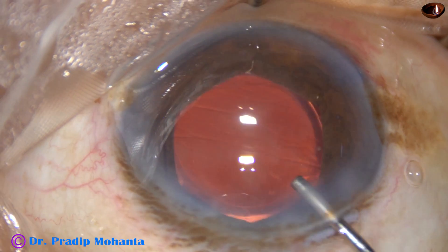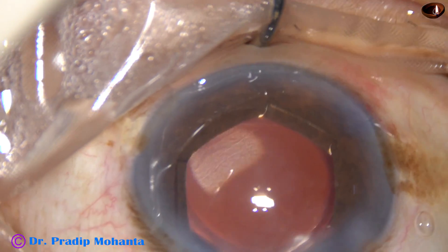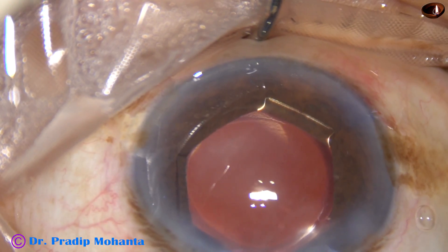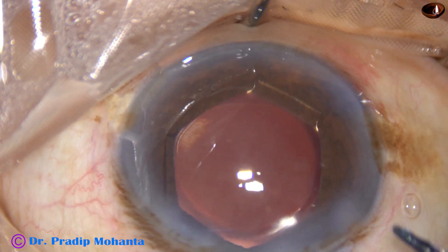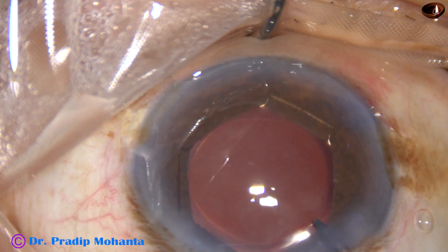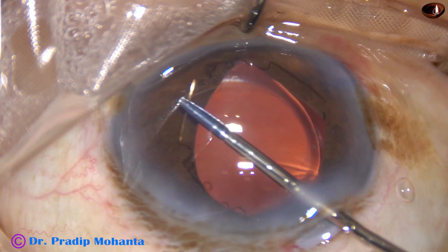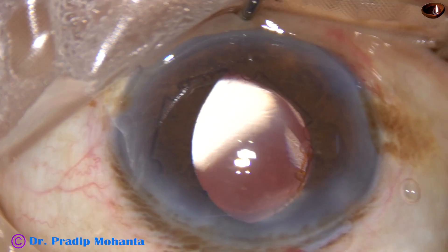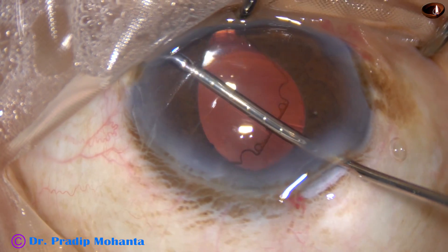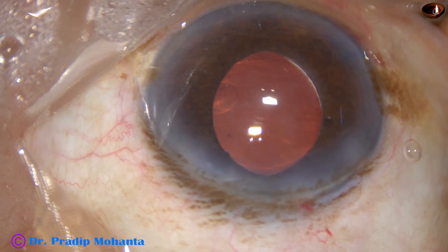Now I am going to remove the B-Hex — see how it is done. I inject visco and take the B-Hex forceps, 23-gauge. I hold the flange at five o'clock and pull it centrally to disengage and untuck all the flanges. I then hold the flange at five o'clock, take it further inferiorly, catch hold of the flange just in front of the main incision, and gently pull it out.